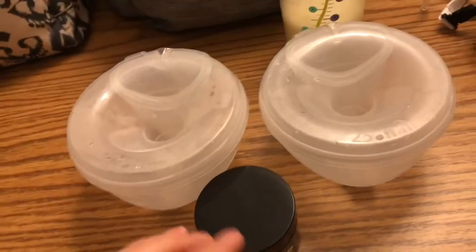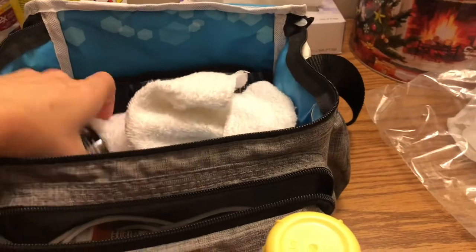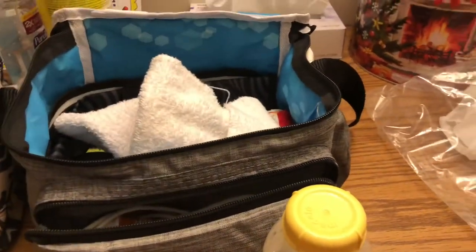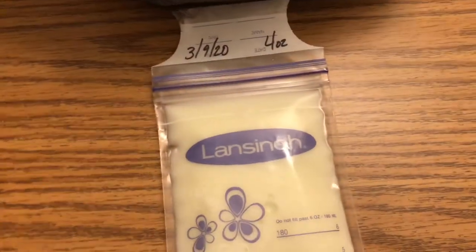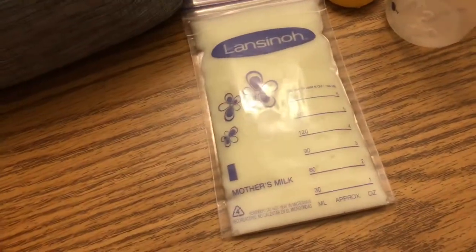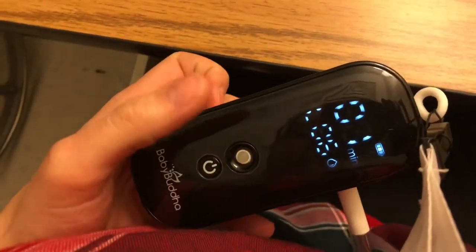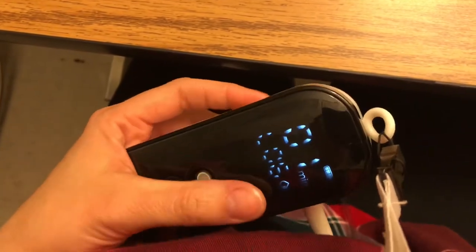I'm about to apply some of my balm. It's also good to have a tissue once you put on the balm, because then you can use it to wipe your finger off the extra balm. I just dated it with today's date, which is March 9th, 2020 — there's four whole ounces in there, which is good for a whole bottle. I've got my pump setup going on right now.